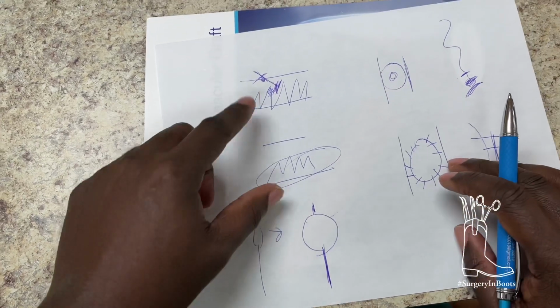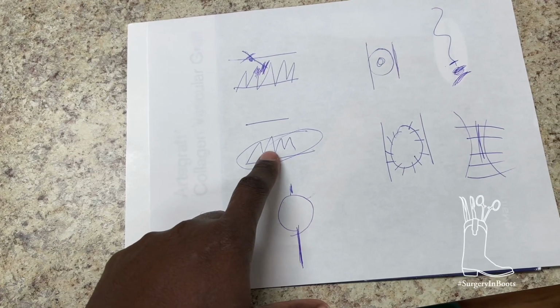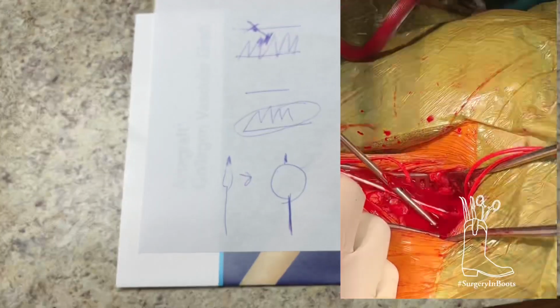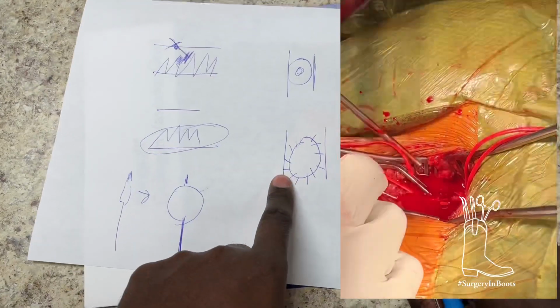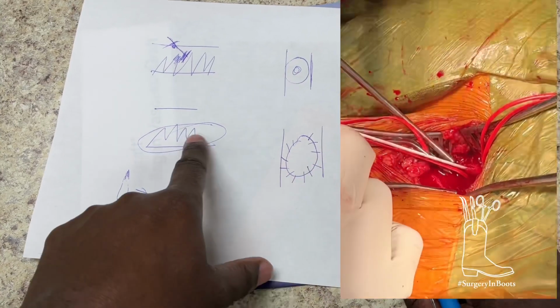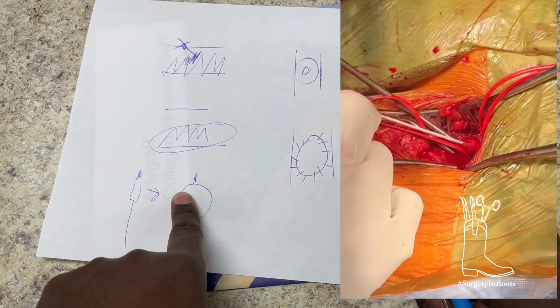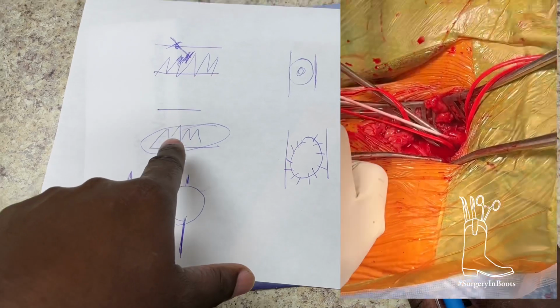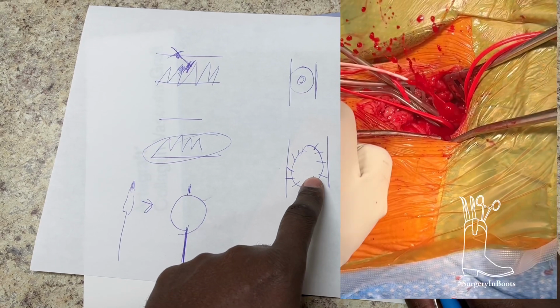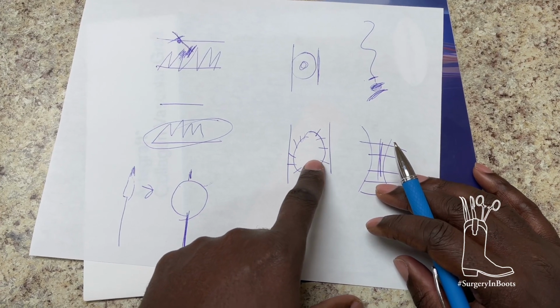We first went in, took this out, made this hole bigger, pulled this out, then used this to get the clot out from above, and used it to get clot from the leg from below. Then we go back in and close this hole up. When we remove the clot with these, that's called an embolectomy. When we remove the plaque, it's called an endarterectomy. And this is called a patch angioplasty, or basically patch closure.